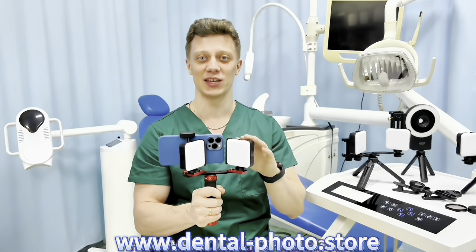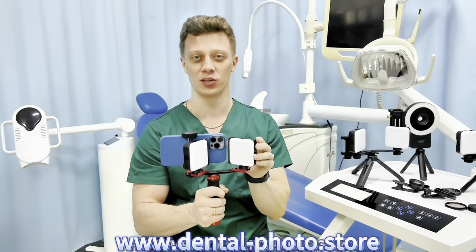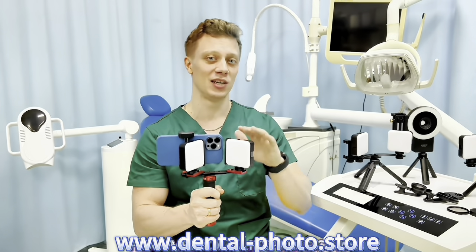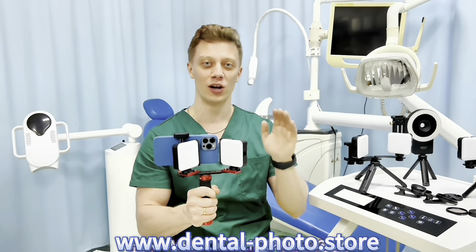The maximum brightness of this model is 840 lux, and of course you can control the brightness at the back of the lamp. The battery capacity is 2500 mAh and you can use this product for four hours straight.